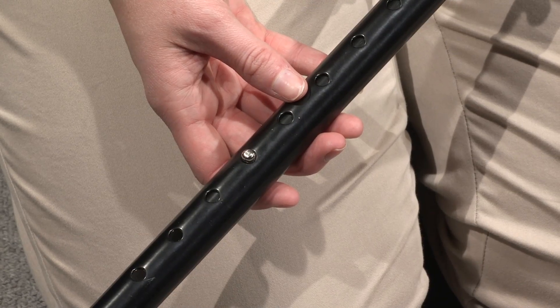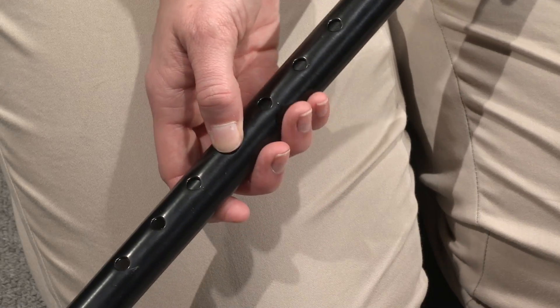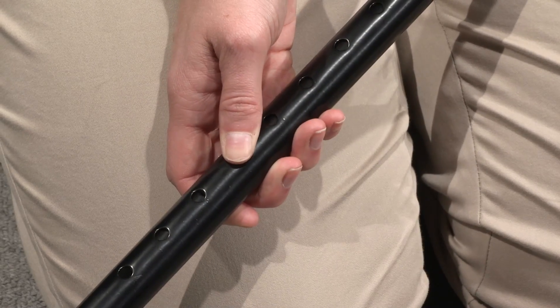In order to adjust the height of the cane, use the buttons on the side of the cane to move the device up or down, and make sure they are secure in their position before using the device.